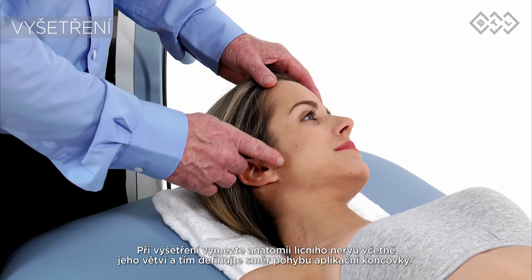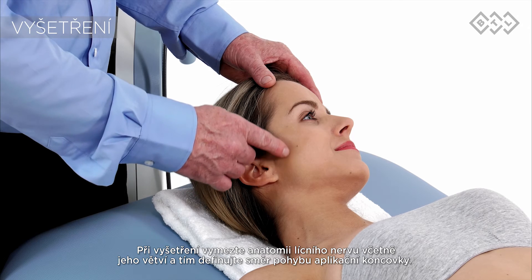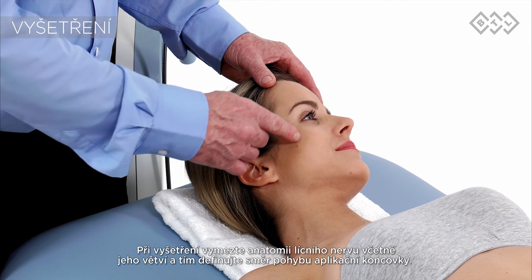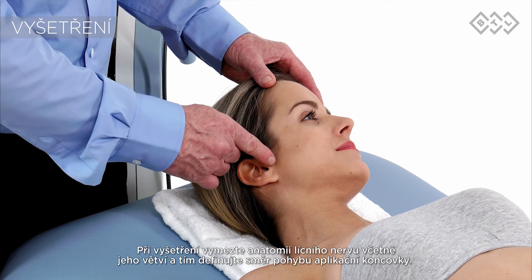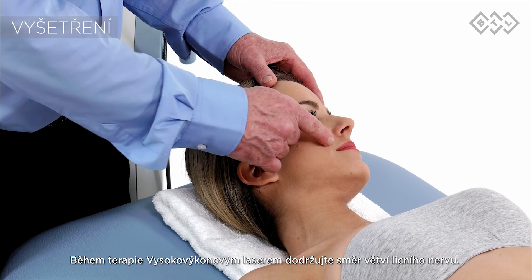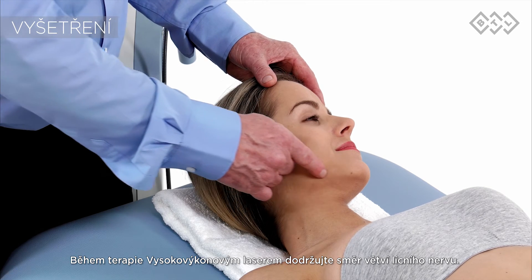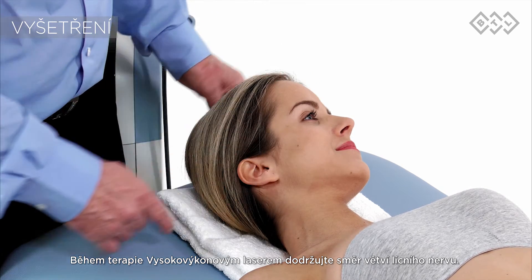Upon examination, define the anatomy of the facial nerve and its branches to define the direction of the applicator movement. The high-intensity laser therapy respects the direction of the facial nerve branches.